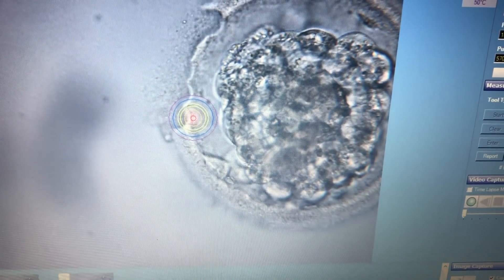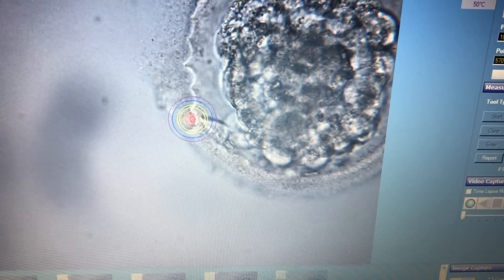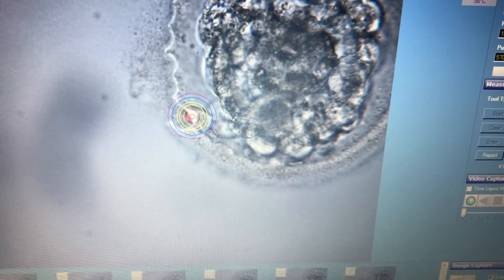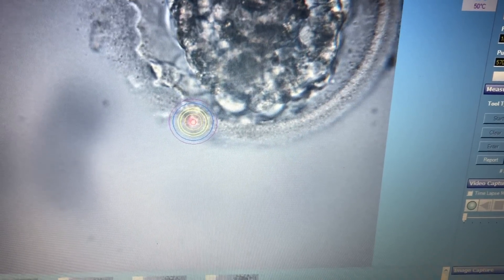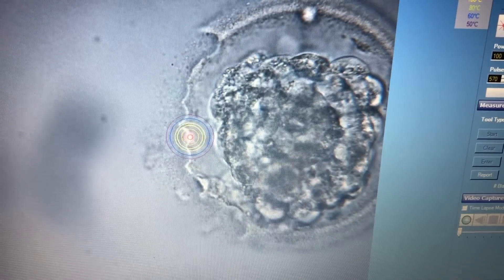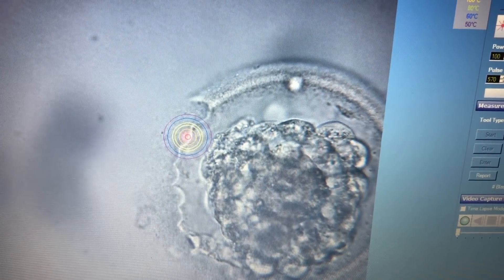This is the time where the impact of the hatching is maximum, and as you can see, rapid pulses can be fired through the zona pellucida in order to break the embryo open from the surrounding zona. In such embryos we are able to fire many more pulses and we usually fire till the 5 o'clock position, meaning approximately one-third of the circumference is fired.